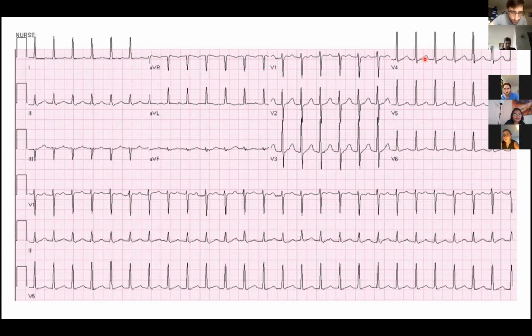The only thing that I can see potentially as a P wave is in the long lead V1, in the later beats. You mean this, right? Yeah, it's like on top of the T wave in some beats. Okay. Whenever you're looking for P waves, I think V1 is a great lead, and we'll go over later why that's important, but you should focus your eyes on the inferior leads, especially lead 2, and V1.